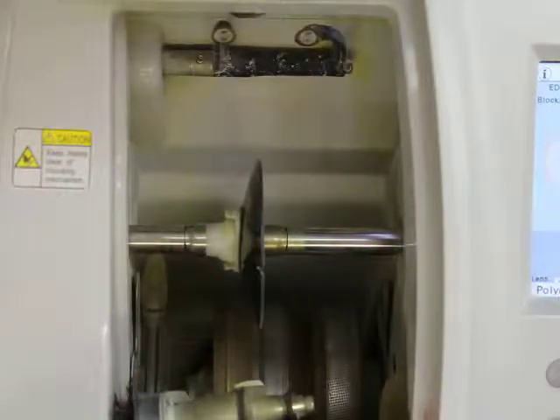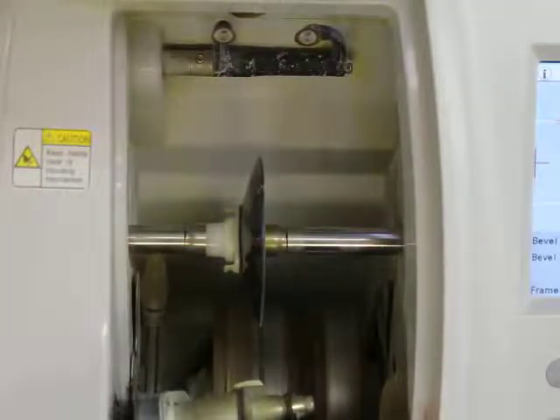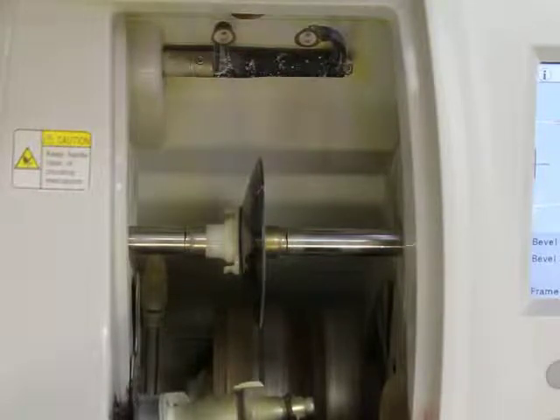All right, now we're going to pick it and put it all the way to the front of our bevel and we'll let it rip. Here we go. We'll first cut it rough. This is polycarbonate, so it's going to do it dry.